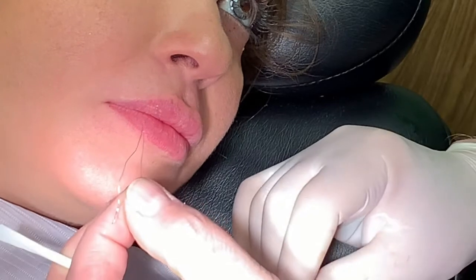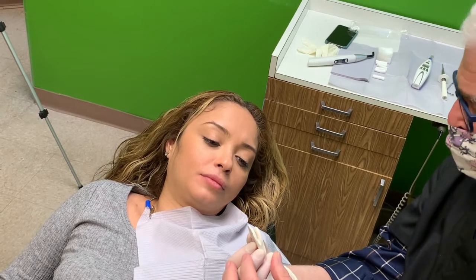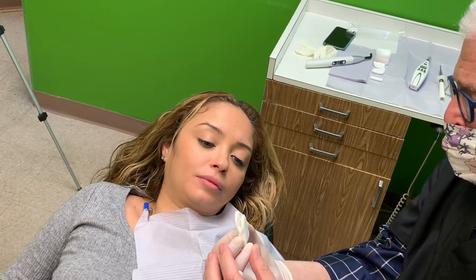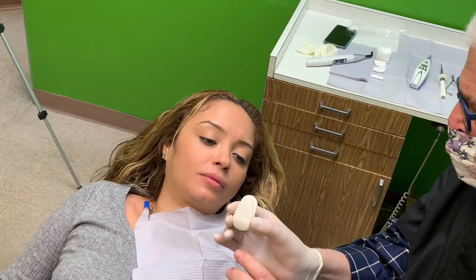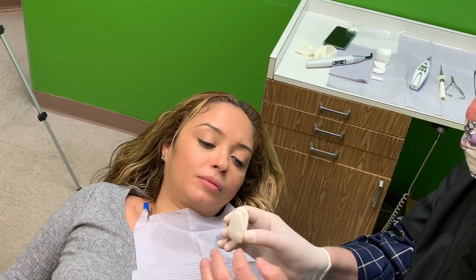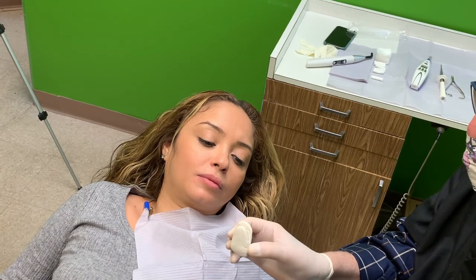Now let's show it in Gloria's mouth. Gloria, for the purpose of teaching you how to do the wiring yourself, this is what a bracket looks like. There's a bracket on your upper teeth, and the bracket on the lower teeth turns around, and the slot points down. Slot pointing up on the upper teeth, slot pointing down on the lower teeth, so that when we put the wire on, the wiring is going to pass into the slot of the upper teeth and around through the slot of the lower teeth.